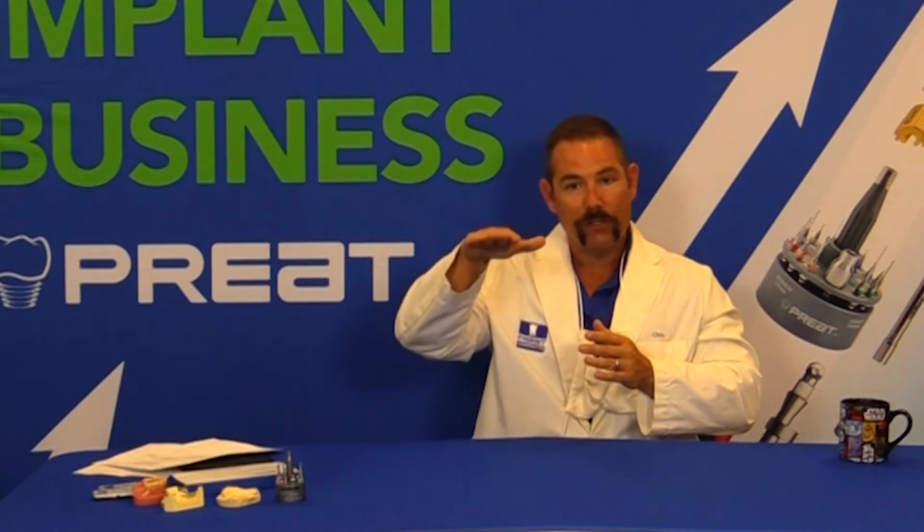If we're designing this case to retrofit a case like this where we have a problem where the patient has had multiple fractures of acrylic, of denture teeth because of this fulcrum and this flexure, we can do a couple things. We can reduce and eliminate the action of the clasp on that terminal abutment to try and allow some movement of that free end side or that tooth supported side, or we can retrofit the framework to include a hinge. So, thinking about it again, tooth supported, bound, tissue supported, movement.